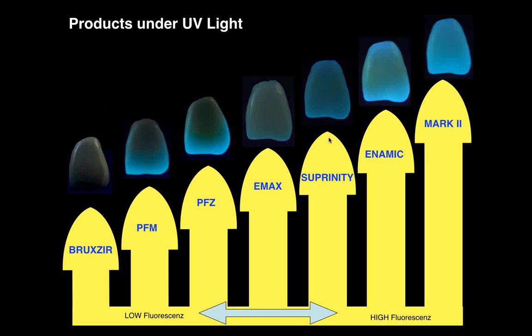People start saying, yeah, we can put some fluorescing glaze on it. If you do that, what happens is usually after bonding a crown and you start polishing somewhere on the crown, basically you'll hurt the glaze and your crown becomes spotty or patchy under UV light. So I don't believe in these UV enhancing glazes. I think the material should have enough fluorescence.